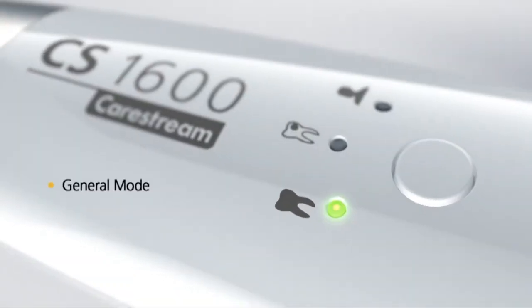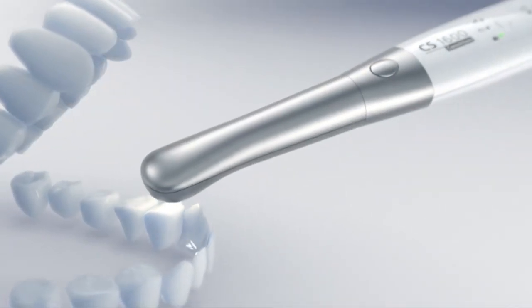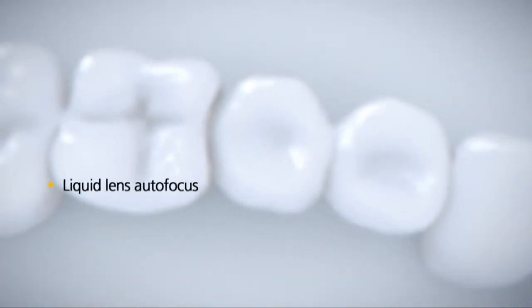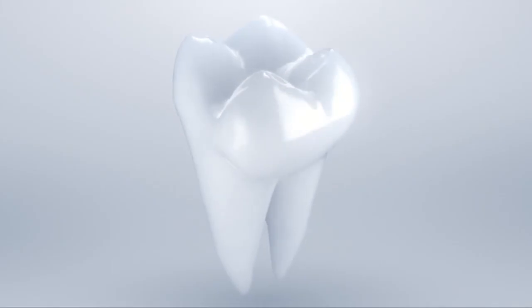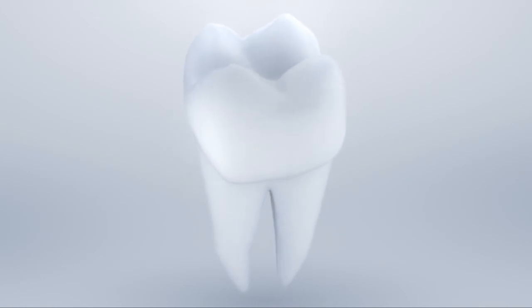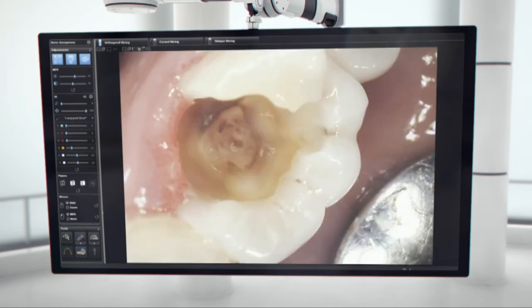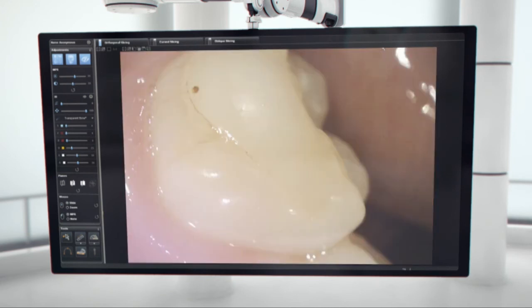Capture both video and high resolution still intraoral camera images in general mode. True liquid lens autofocus technology works like the human eye, with no manual adjustments necessary. The optional polarizer removes the glare present in standard intraoral cameras, which can often mask caries and other conditions, to produce more reliable results. The CS1600 captures the highest quality images in the widest range of views for enhanced patient care and communication.